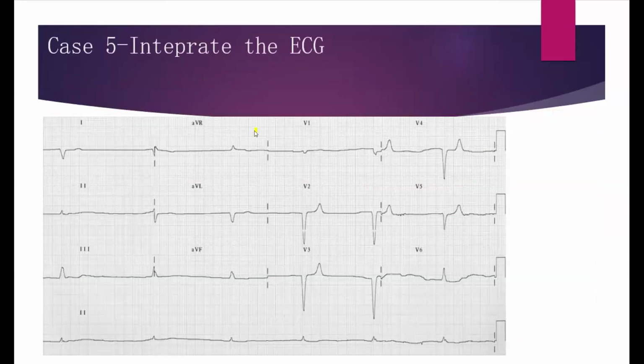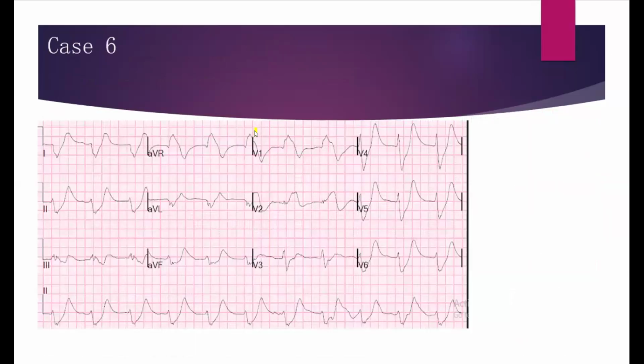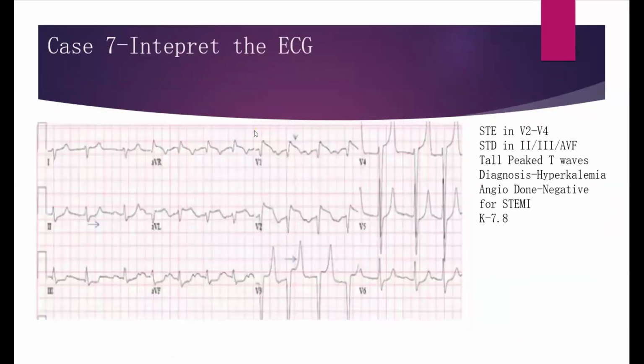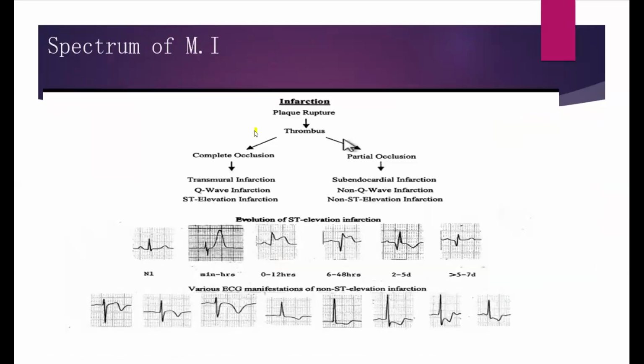All right, so let's move to something I want to move to first. We'll come back to the T-wave abnormalities. So let's go to MI abnormalities.